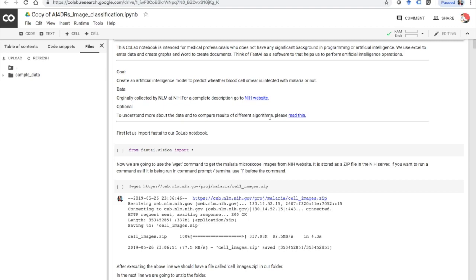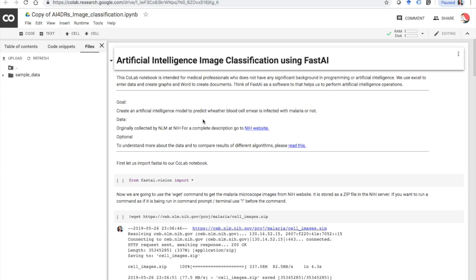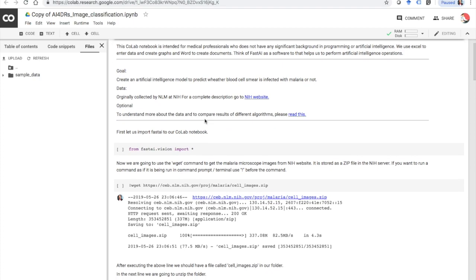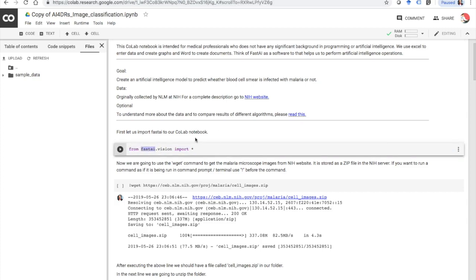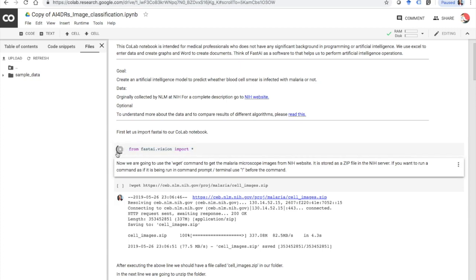Just like we use Microsoft Excel to enter data and create graphs and Microsoft Word to create documents, in this we are going to use a tool called fastAI to do the artificial intelligence programming. First we have to import that package fastAI to our notebook, and this is done using the line: from fastai.vision import star. This is going to import all the libraries essential for image classification. To run a cell you can either click the play button or press Shift and Enter while in the cell.